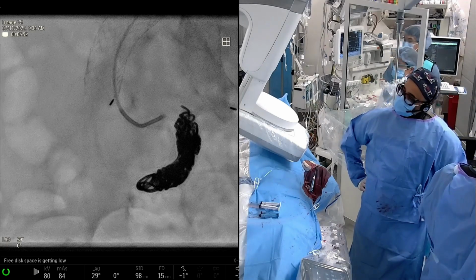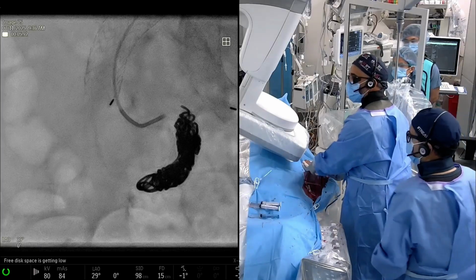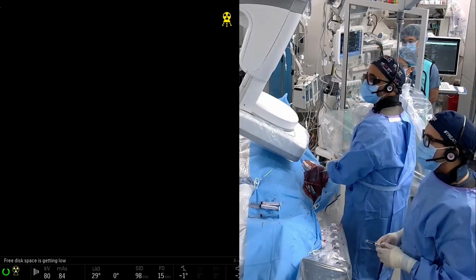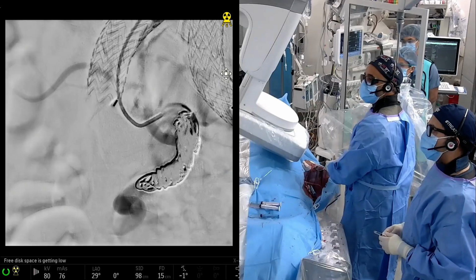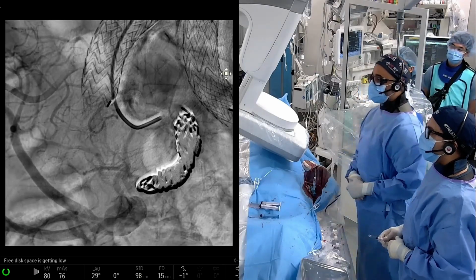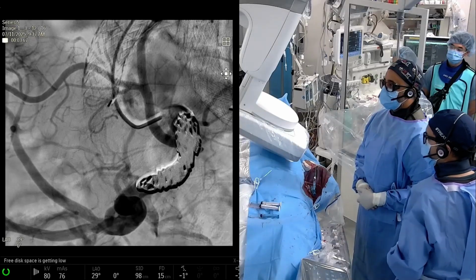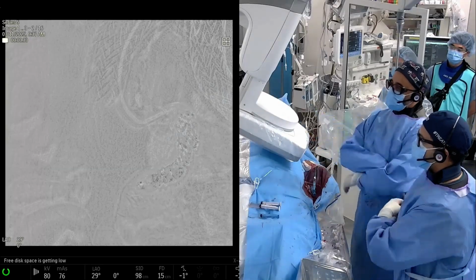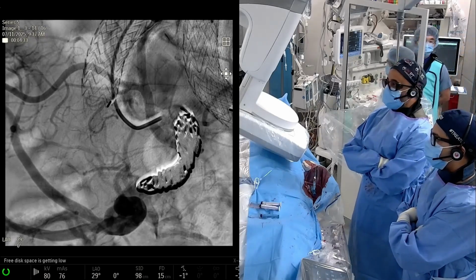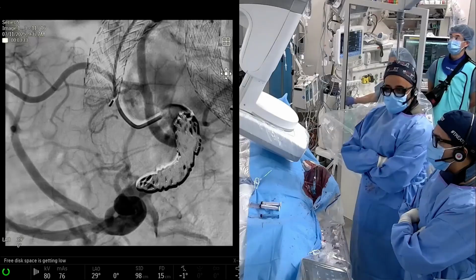Actually, although I think we have enough space. Maybe we can just get a regular 035 packing, another 035 packing here, right? Yeah, I bet you do. Look at the brand. It's going to be tight, right? Yeah. Yeah, some of it is that the top little part of the coil pack isn't really packing anything. Yeah. Because it's just sort of floating in the breeze.